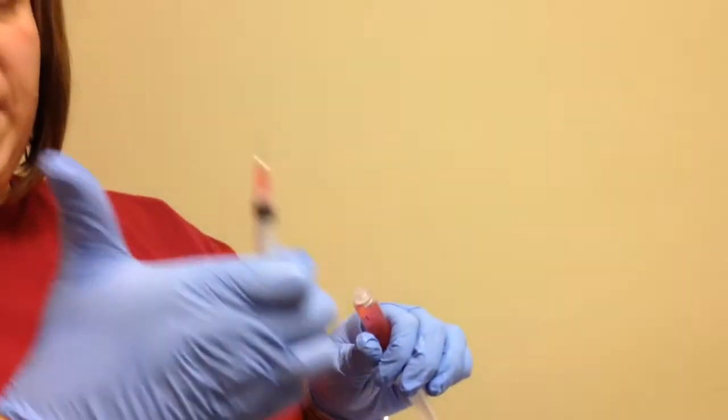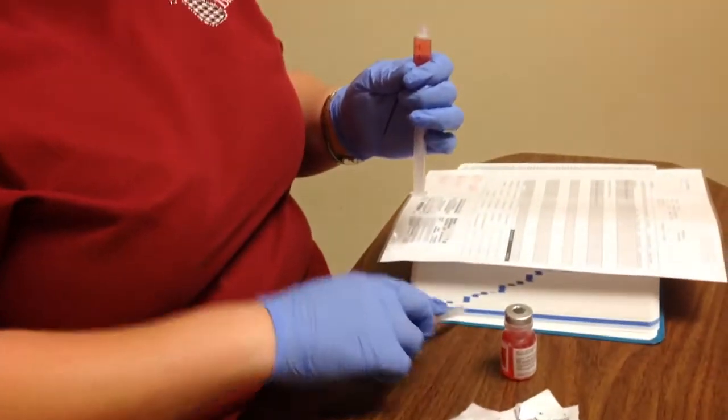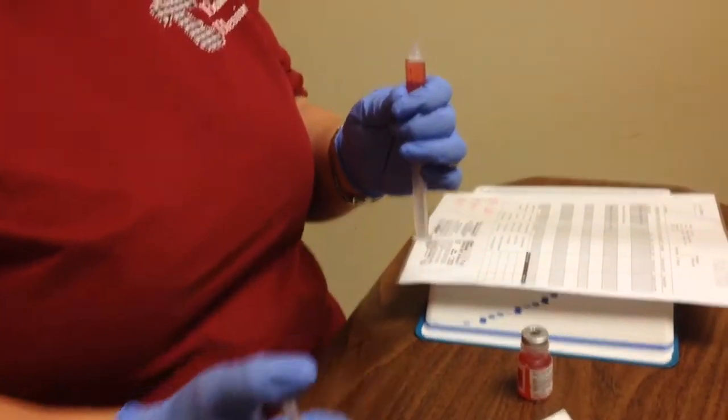Okay, activate your safety device. If it were a blunt tip needle or something like that, you can always do your little scoop method. This will go in the sharps container.